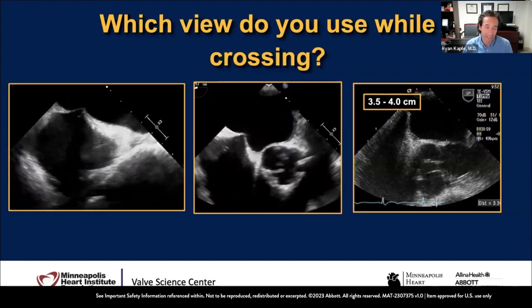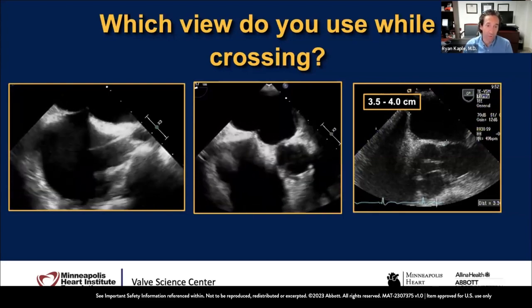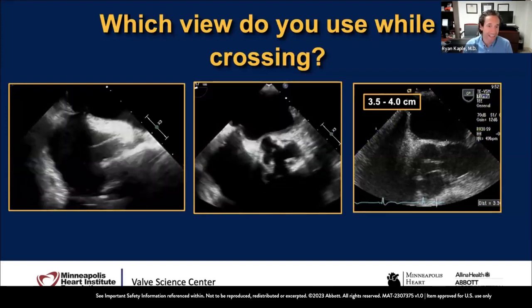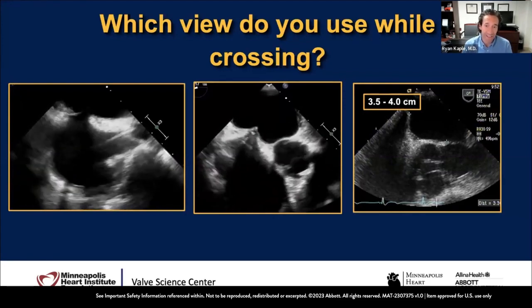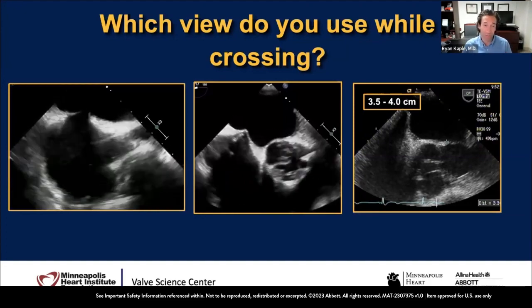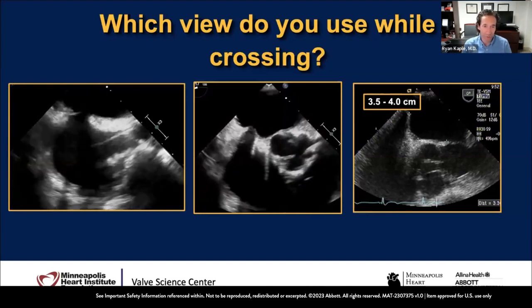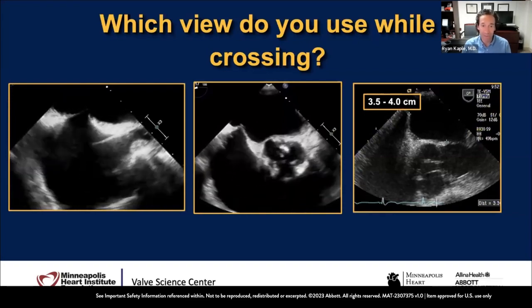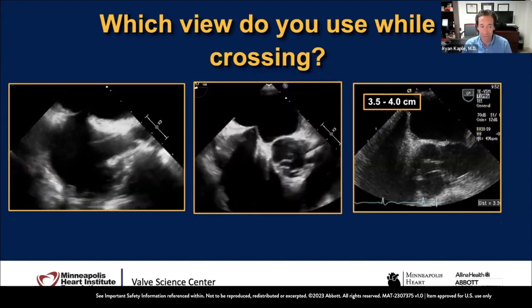And I think for me on the transseptal, it's the bicaval, and then just waiting, cutting a straight axis through a short axis through that bicaval view, and just being patient and making sure you see a good tent, making sure it's safe. This is really the time to slow down and make sure that communication is two-way, back and forth, so that everyone feels comfortable. And I always triple check before we use the radiofrequency to go across the septum, making sure that everyone in the room, including the clinical representatives, feels comfortable, because this is the time to make sure everyone's on the same page.